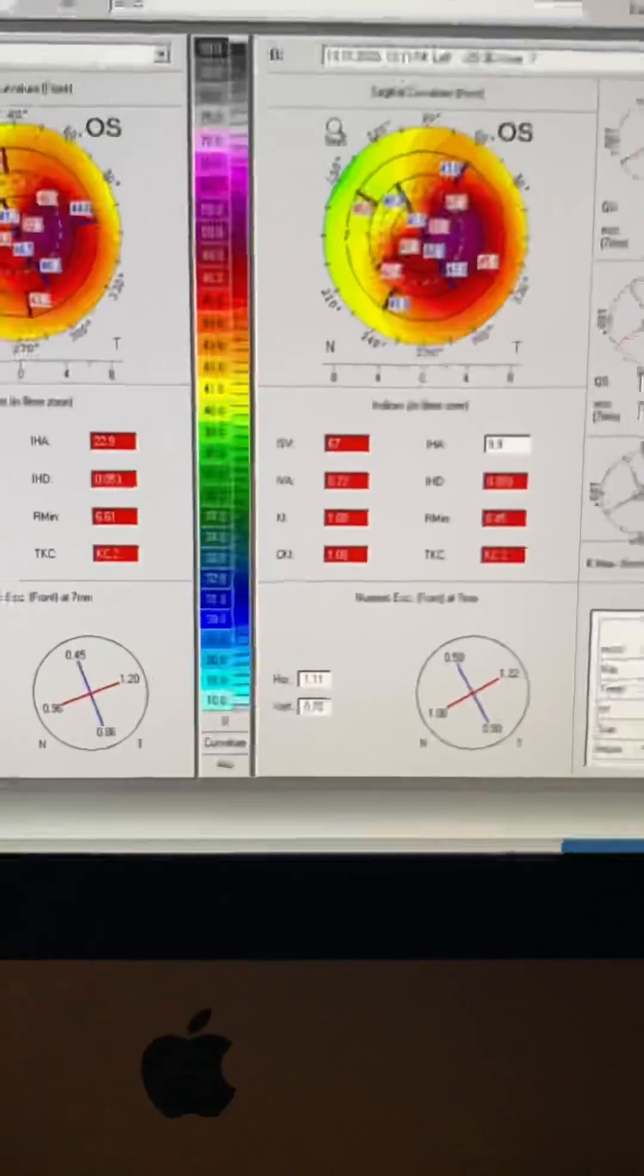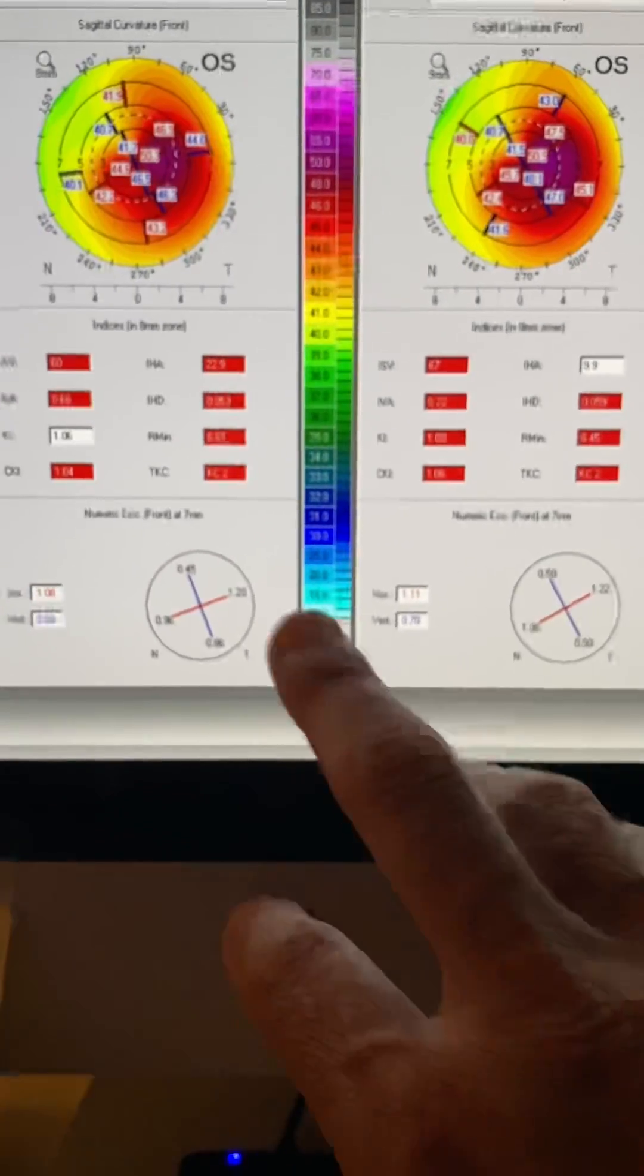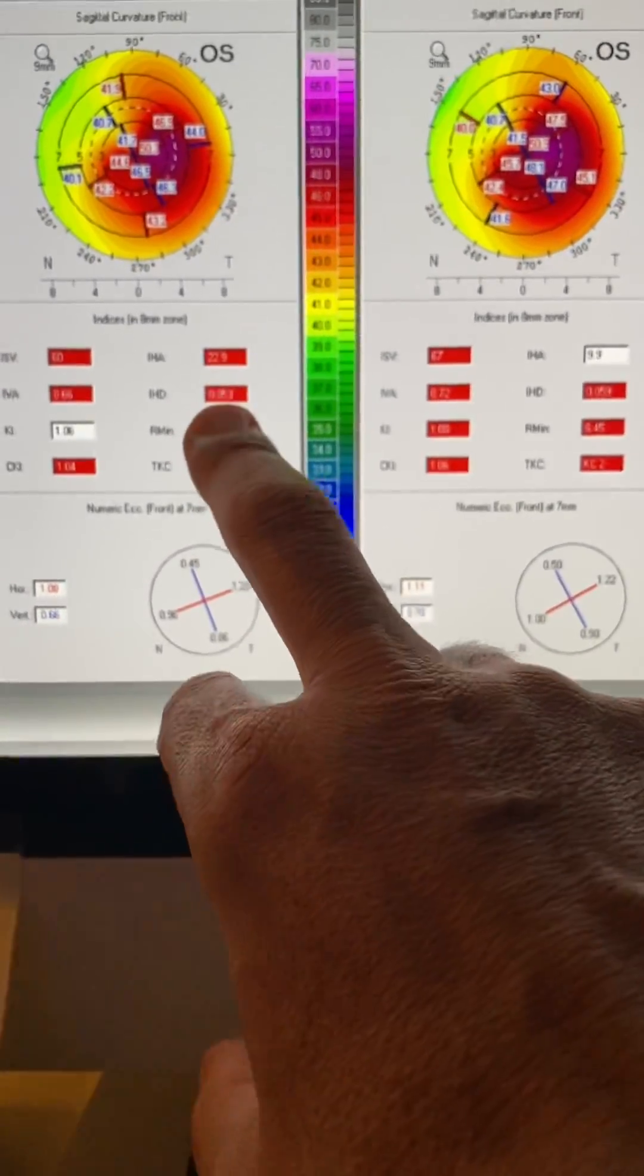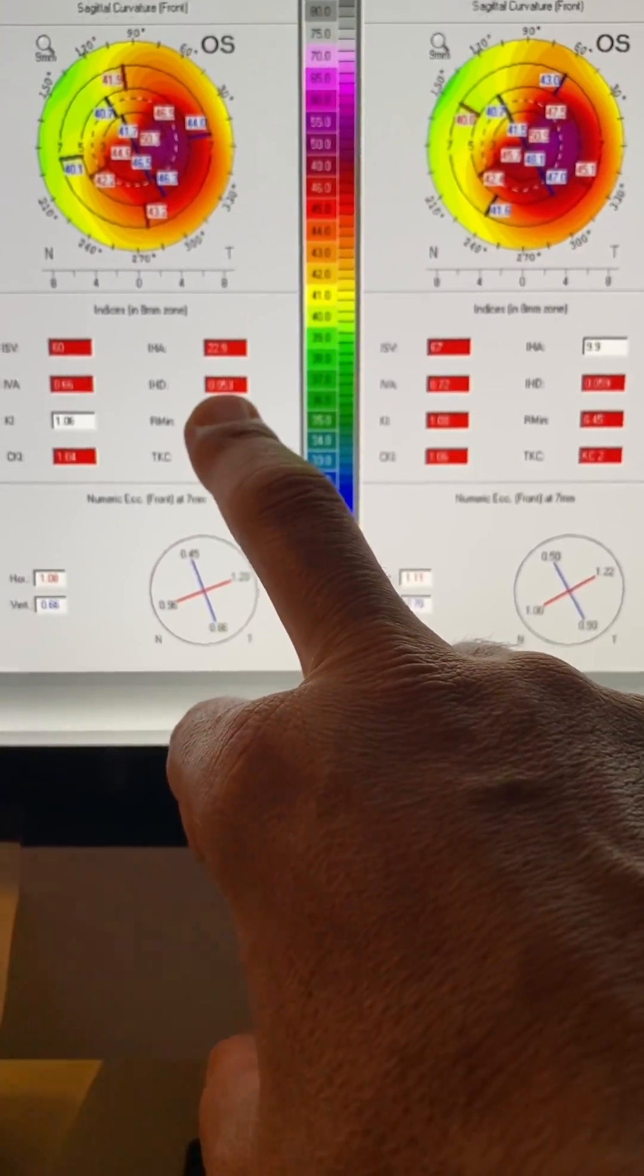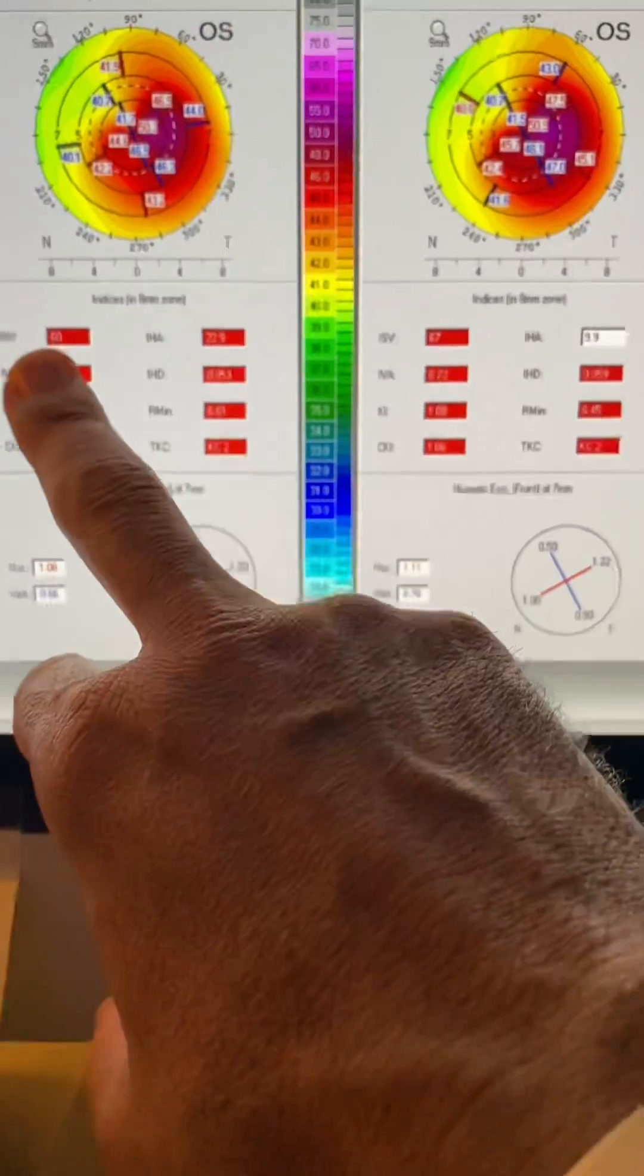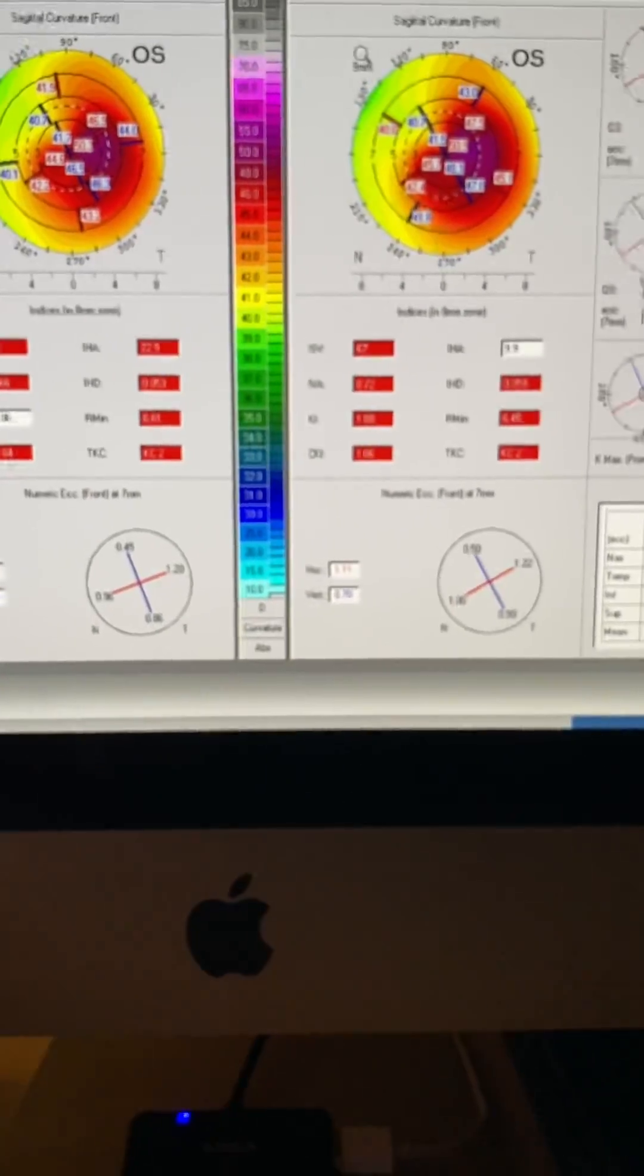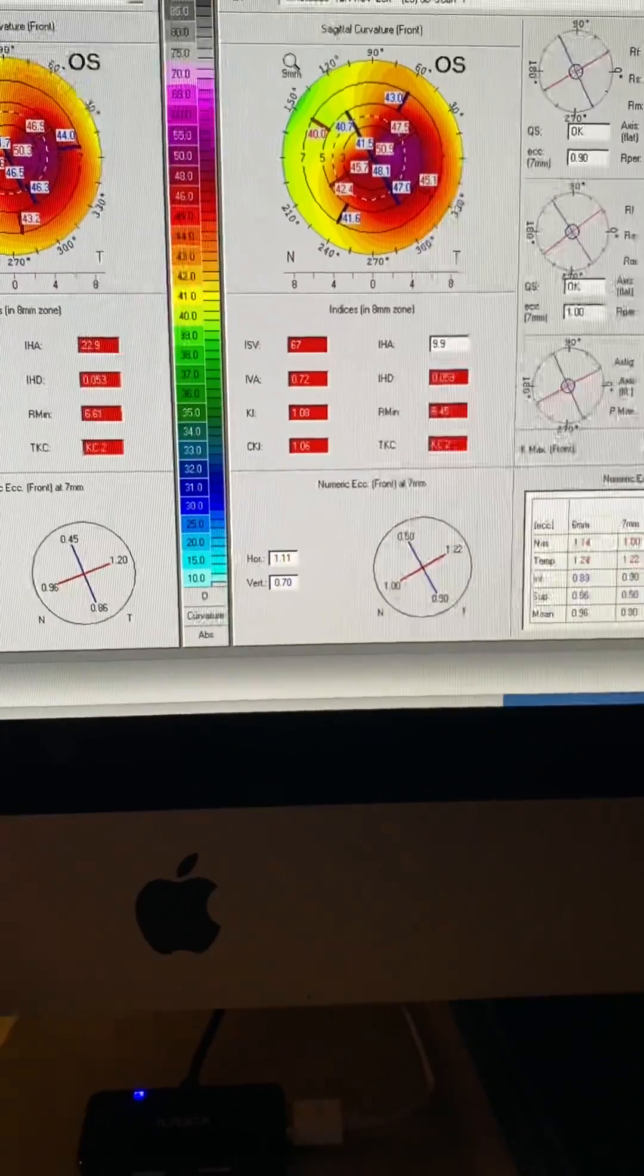We're trying to look at the topometric indices. And we've shown that the IHD is a great indicator of the progression. We were at 63, we're almost at 70, and ISV was 60 and now is 67. So we certainly have progression here.